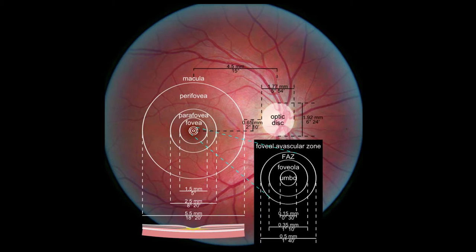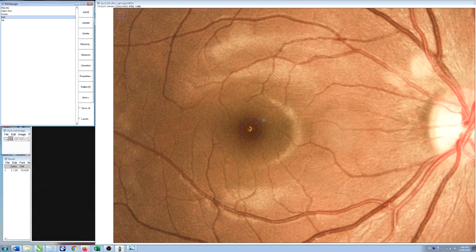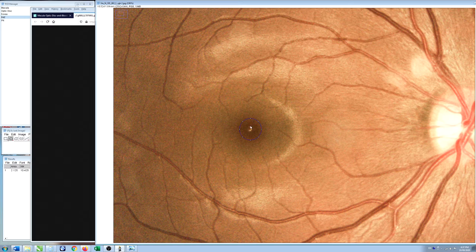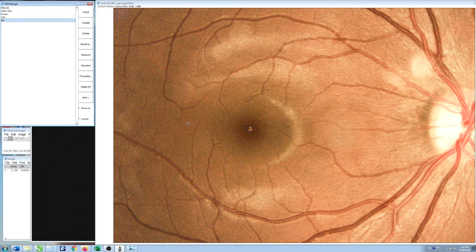In the center of the fovea there's a smaller structure called the foveal avascular zone, which is the point where all blood vessels stop. The foveal avascular zone is about 0.5 millimeters in humans. Right in the middle is the foveal pit — where virtually every bit of tissue has been pushed off the top of the photoreceptors leaving just this pit. In actual photographs you can see a bright rim of reflected light from the base of that pit. The foveal pit is 0.15 millimeters, or 150 microns, in diameter — really, really small.